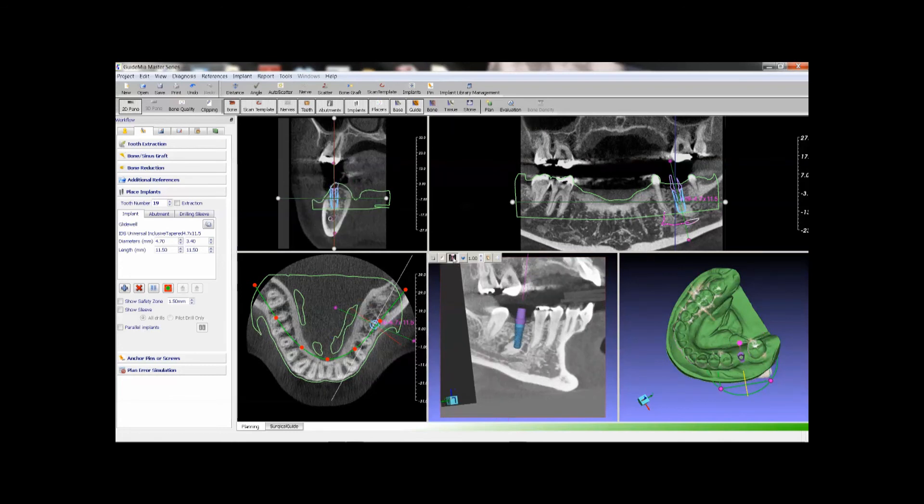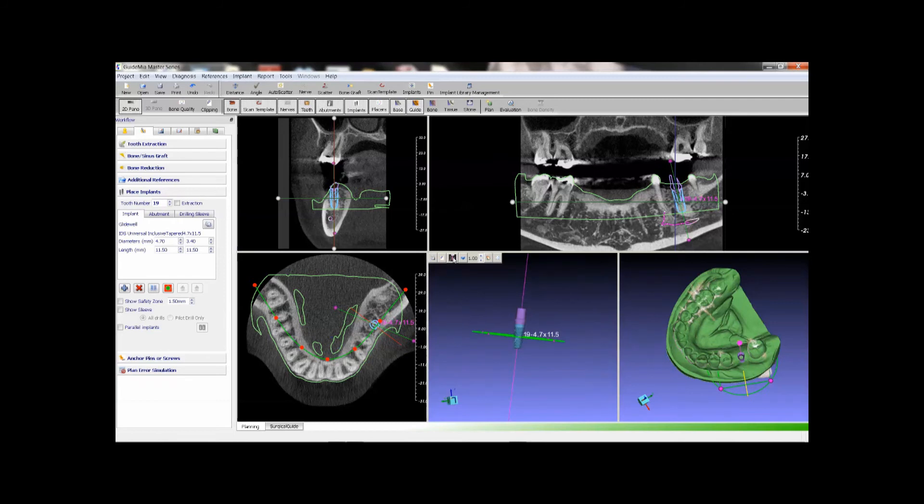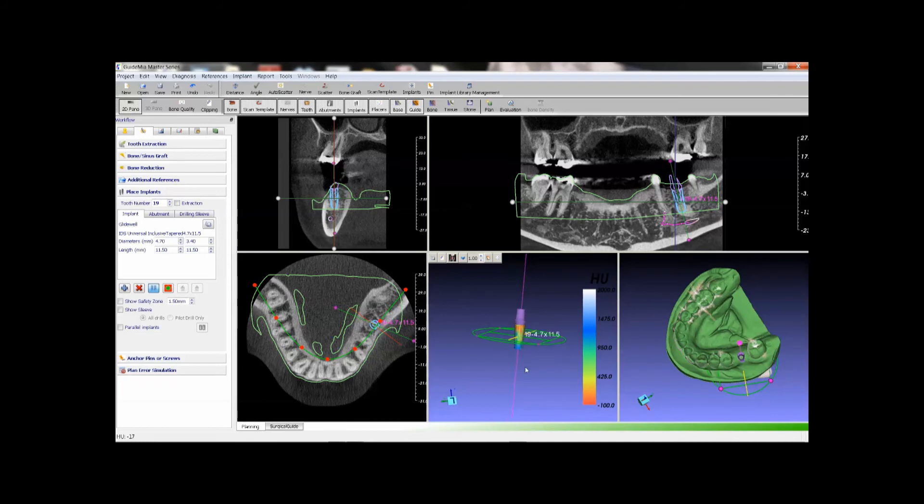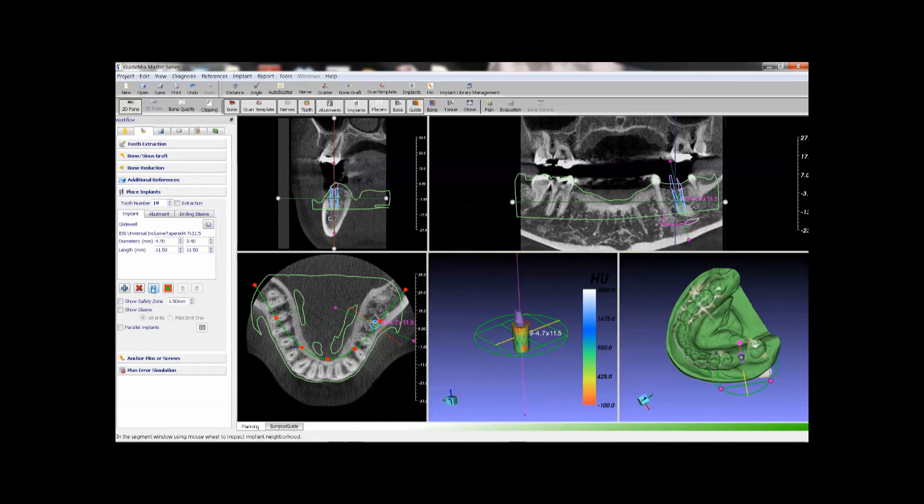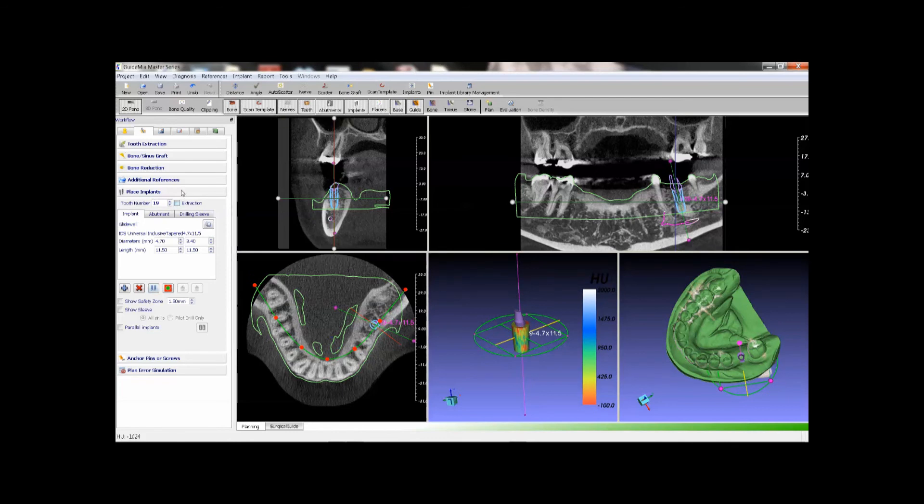Turn off the cross section mode. Now we inspect the bone density of the surrounding area. Notice the color is mapped to Hounsfield unit values. Green and blue indicate good bone density, orange might be a warning sign. Use mouse wheel to change the size of the surrounding area. Quit from the tool.